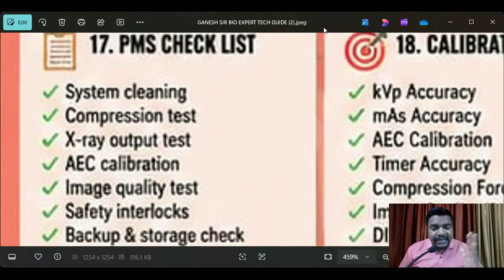That depends on critical equipment, non-critical equipment, major equipment, minor equipment. So for all kinds of equipments in the hospital services, an individual PMS checklist is there, and every monthly basis we have to finish as per schedule, quarterly, half yearly. So whatever is assigned to you, those engineers definitely have to finish the job.